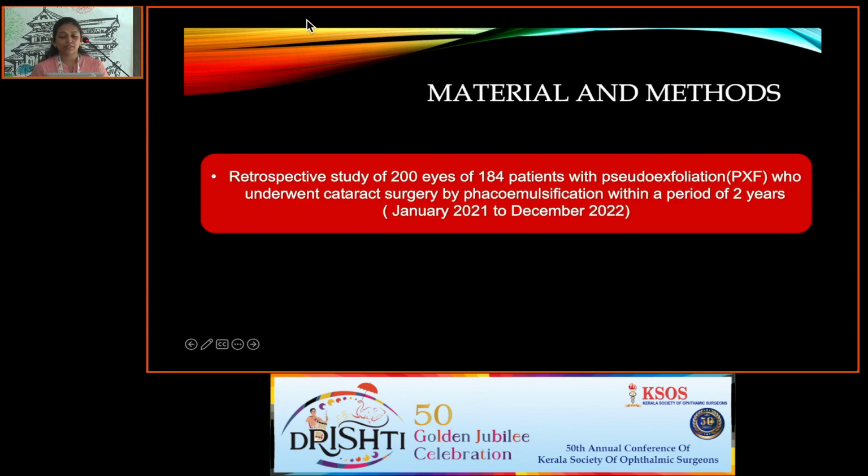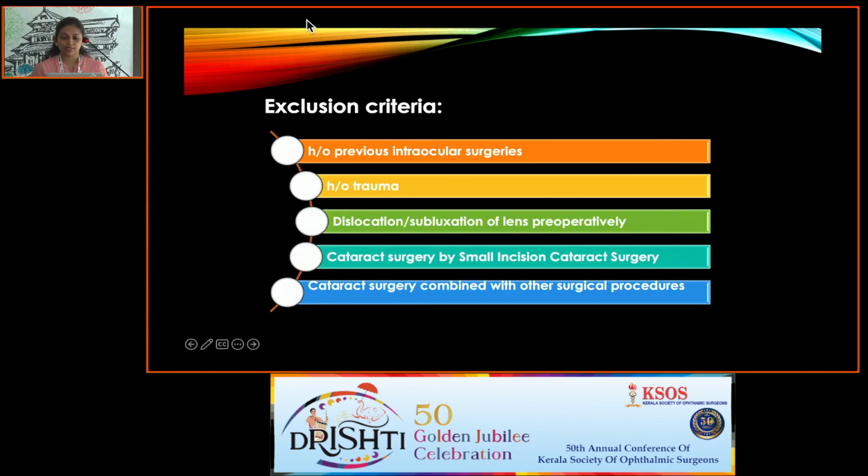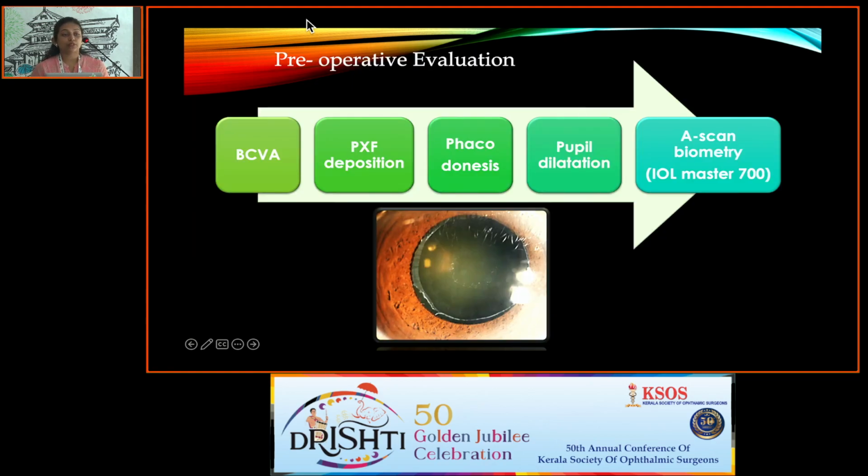Ours was a retrospective study of 200 eyes of 184 patients with pseudoexfoliation who underwent cataract surgery by phacoemulsification within a period of 2 years. We excluded those with a history of previous intraocular surgeries, trauma, obvious dislocation or subluxation of the lens preoperatively, small incision cataract surgery, and cataract surgery combined with other surgical procedures. Preoperative evaluation included best corrected visual acuity, presence of pseudoexfoliation material deposition, phacodonesis, and pupil dilatation. A-scan biometry was done with IOLMaster 700.